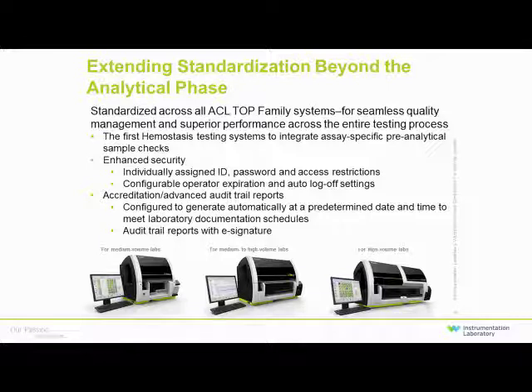And then for accreditation and your audit trails, which are always very, very important. So you want to make sure you get the right results, but then you have to store those results and show those endlessly to people. This area is actually pretty good.